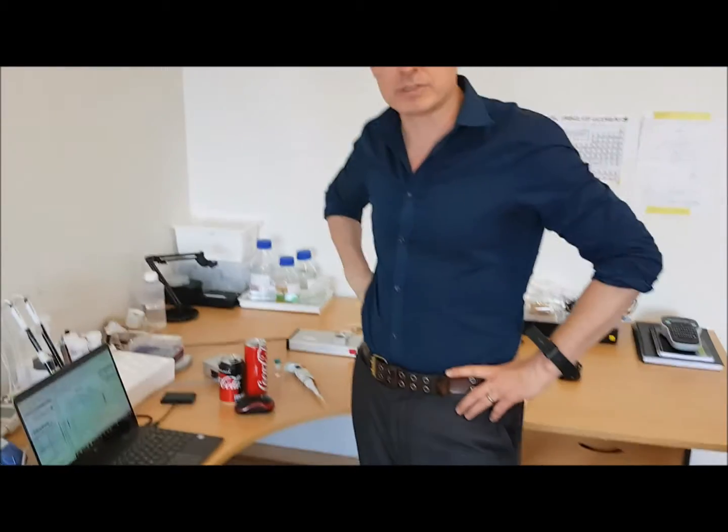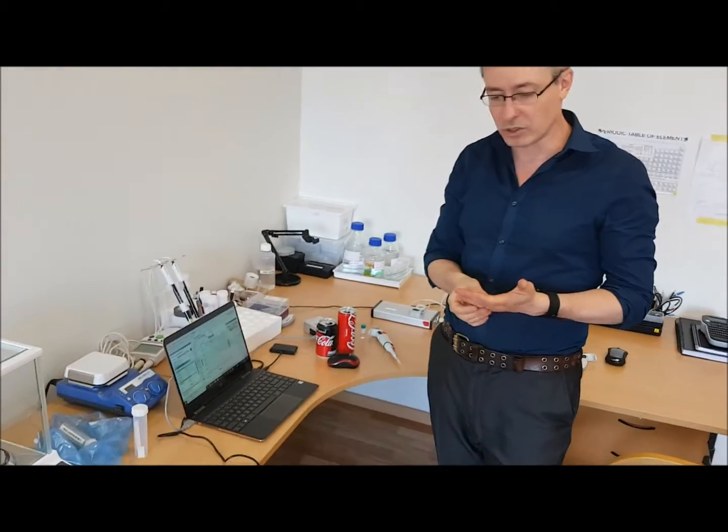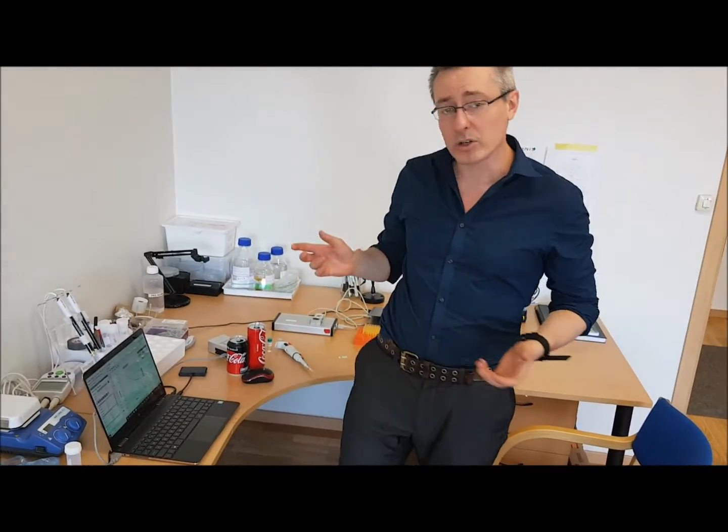I'm going to do a quick video about Zimmer and Peacock's glucose sensors. Zimmer and Peacock make something called the Anapot, which is a small handheld USB potentiostat that comes with scientific software. We also have glucose strips. On our website you'll find standard sensors for glucose, lactate, potassium, hydrogen peroxide, and nitric oxide, along with a small electronics box for running those sensors.